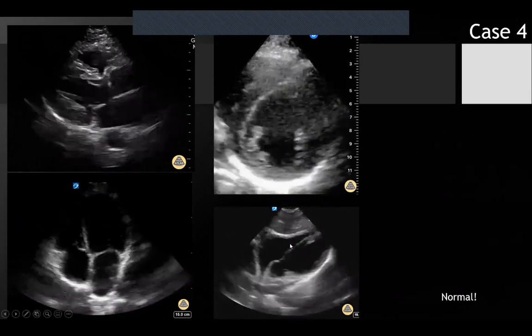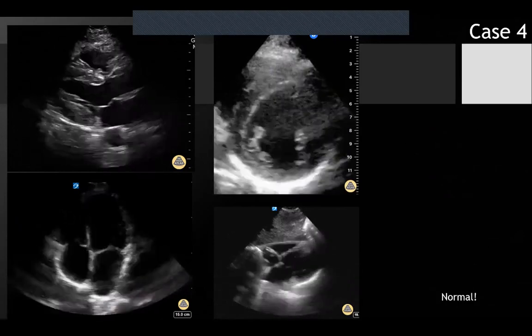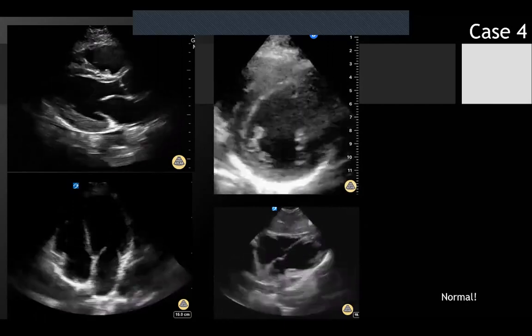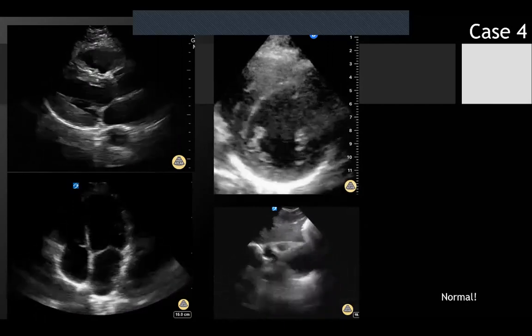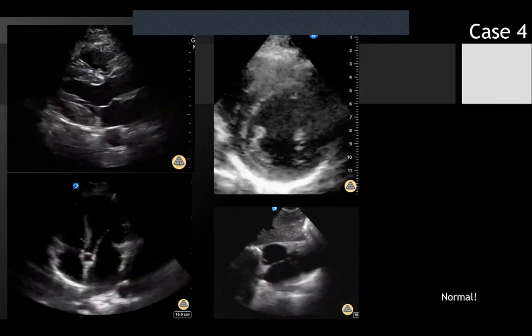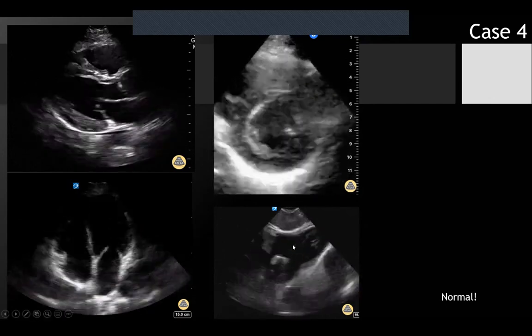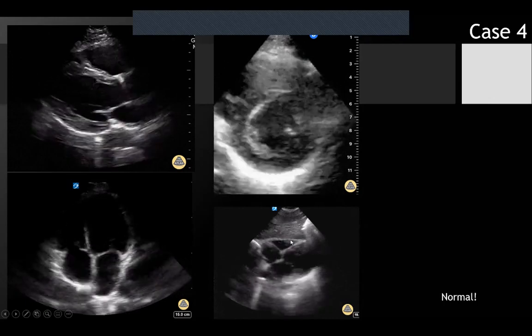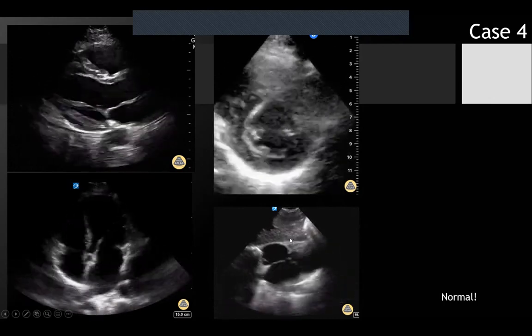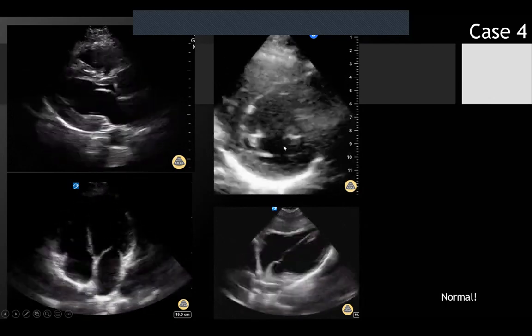Yeah, so this is actually a perfect representation of why I don't think the subcostal view is good for EF. Because this patient is breathing, so you can see that the echo itself grows and changes over time. It's very hard to be on axis. You could very easily call that like 100% EF of the RV, right? Or fractional shortening. And it's really just a function of where it is. And we'll have an RV talk maybe next week even already. But this view for RV function is actually good for getting RV free wall thickness because that's measured well over here. But anything else as far as RV function, really tough to make a call from the subcostal view.